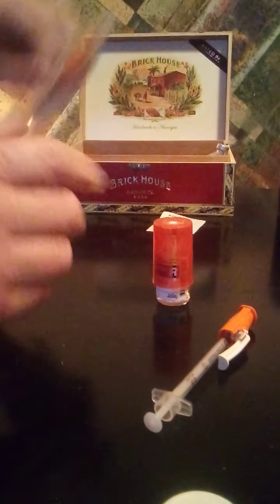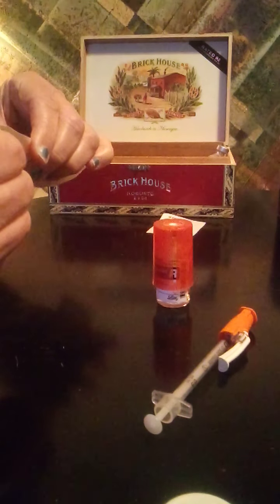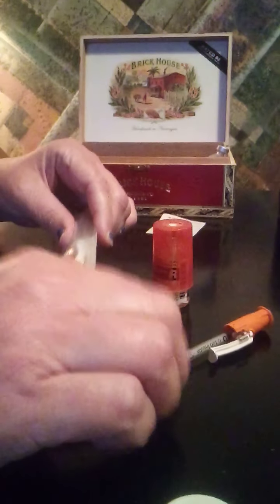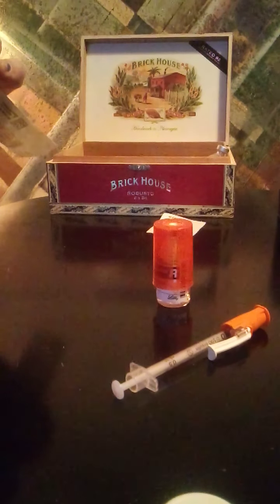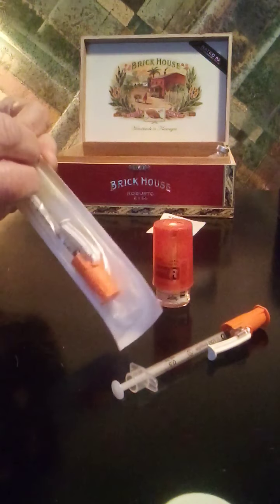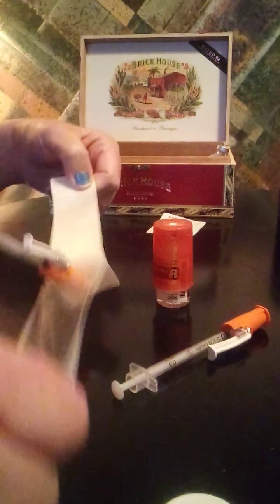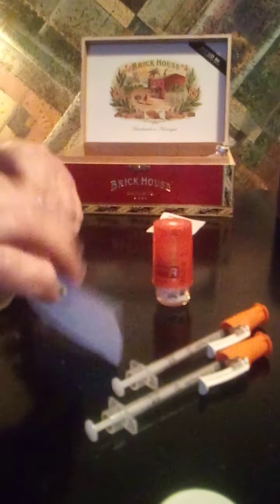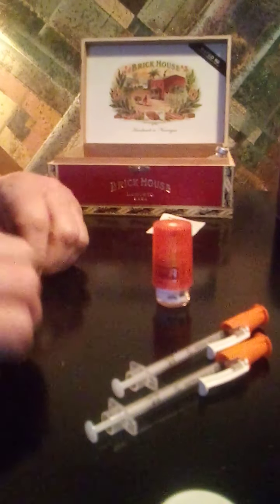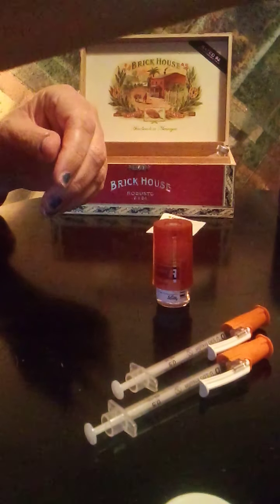The syringe only has 50 units in it, so I have to use two syringes. Instead of using 50 on one and 18 on the other, I'm going to divide the 68 units in half — that would be 34 units in each syringe. Unfortunately, because my sugar is way out of control, I do have to use two syringes. I only have a few 100-unit syringes left, so I was looking at only being able to use these anyway.